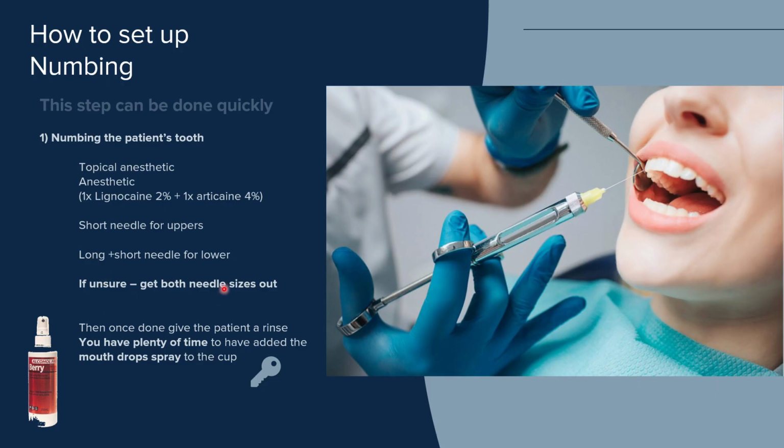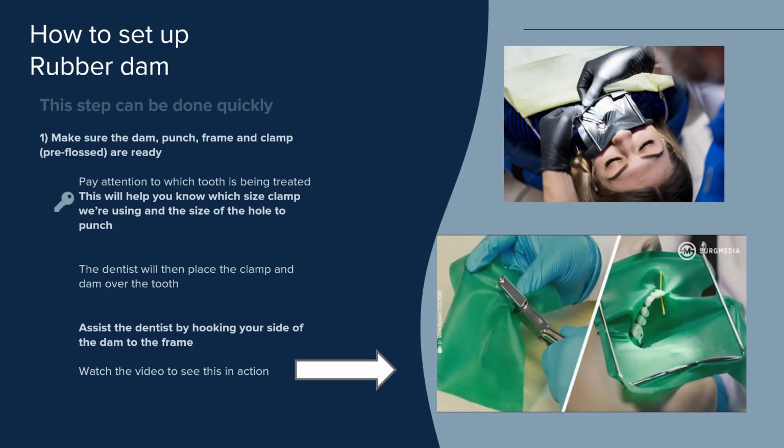It shows you're more prepared. And then give the patient, instead of just water, flavored mouthwash. So we use these berry drops or mint drops. Make sure that's ready because the patient's going to need to rinse. And again, this just allows the patient to have a better customer experience. It takes a second to do, very easy. Patients like it.